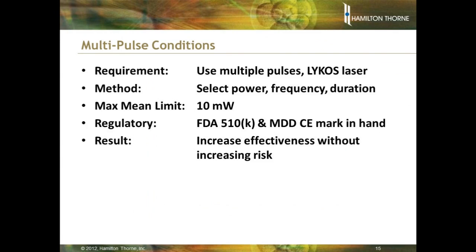Now, an alternative to that is that one can use a system in which one is multipulsing the laser. Everything I've mentioned up to now has been single pulses, but in doing the trophectoderm, it would be an advantage if we were able to use multiple pulses and move the join between the trophectoderm biopsy and the embryo rapidly across the position of the beam. So that's what we have developed.